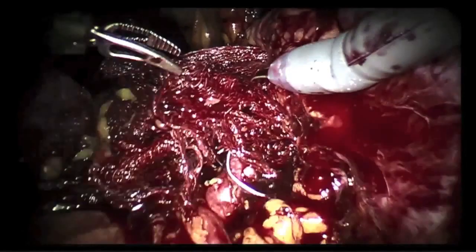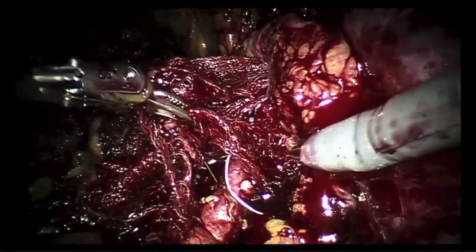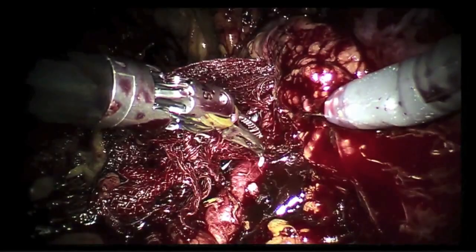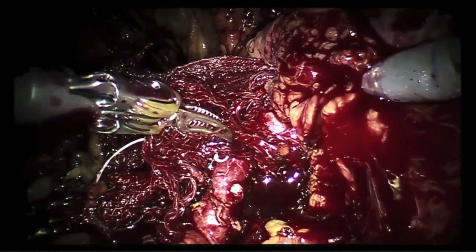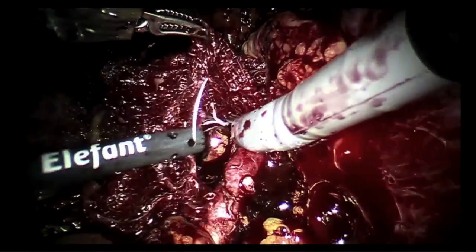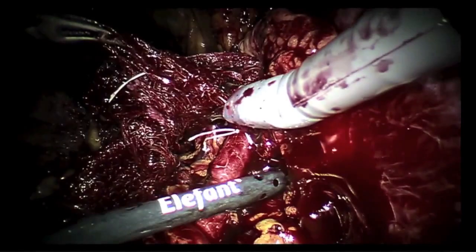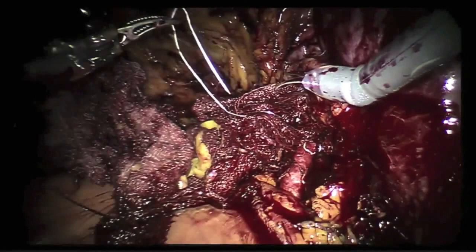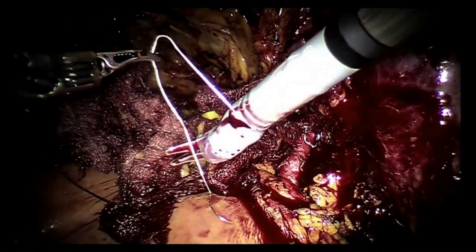Huh? Yeah, I can see the artery. I thought I had cut all this stuff. Painful though this is, getting this stuff off is worthwhile, because it keeps the kidney cold. That is that stitch of mine. Here we go. Here's the needle. Anesthesia, have we given some Lasix, mannitol? Yes. The transplant cocktail? Beautiful.